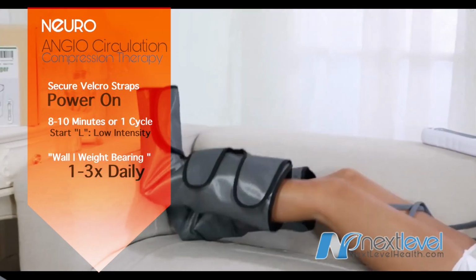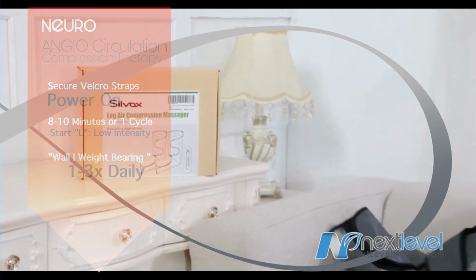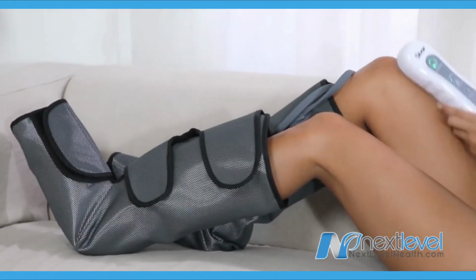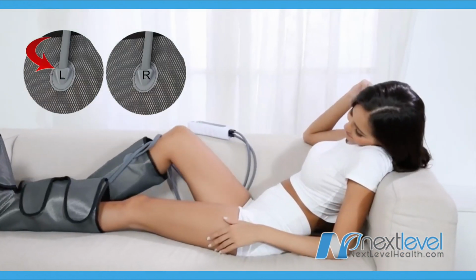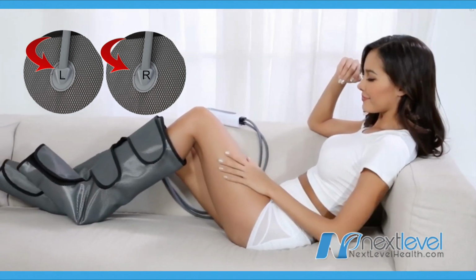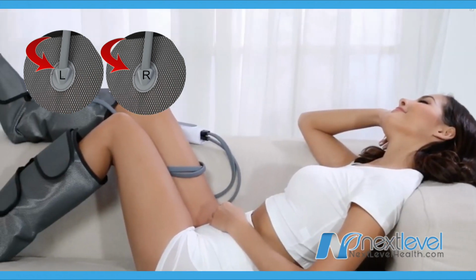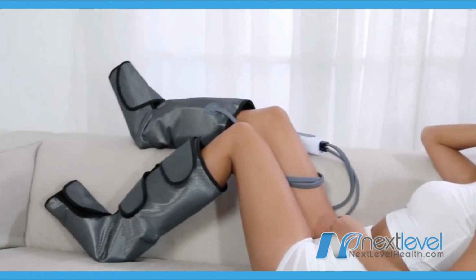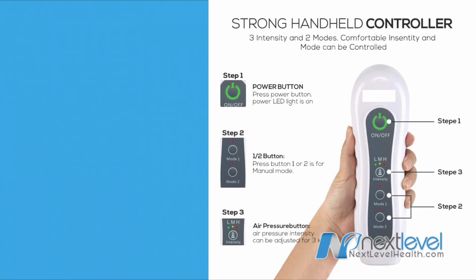Find yourself a comfortable location with preferably you're going to have your legs elevated to zero gravity. Place your legs and your feet within the boots and notice that there is a left side and there is a right side. So where those little cords attach, it'll tell you left or right. Make sure you get them on the right side.